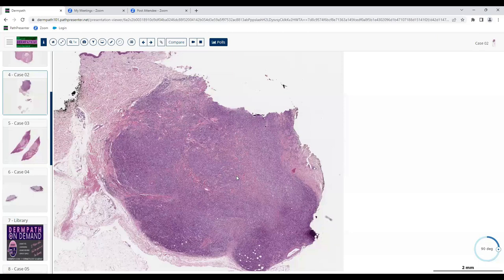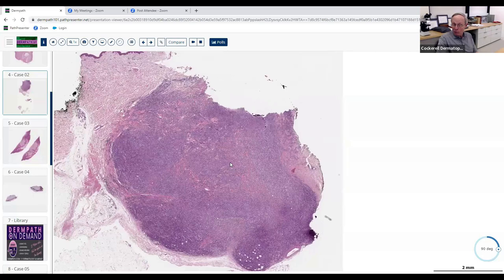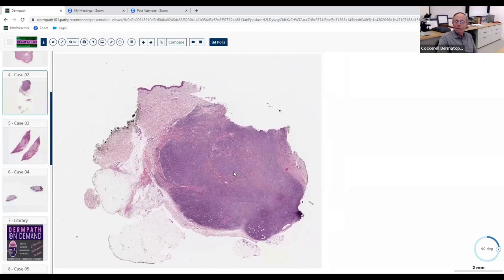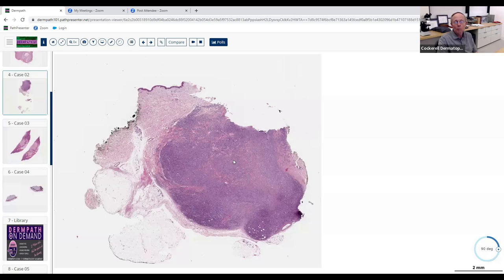So you think it's a neoplasm — correct — and you favor malignant? Certainly yes. It's got that infiltrative pattern, it's also pretty big — this excisional biopsy takes up the whole low-power field, probably a couple of centimeters. It's not well circumscribed, it's poorly defined out here and down in the subcutaneous fat — all the features of malignancy at low magnification. What differentiation do you think it's exhibiting?